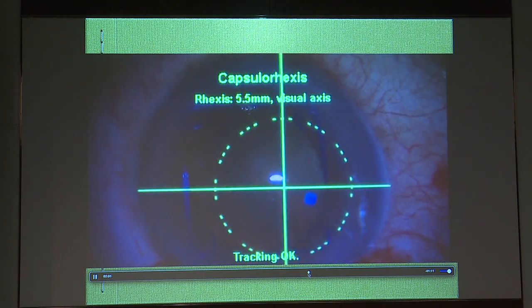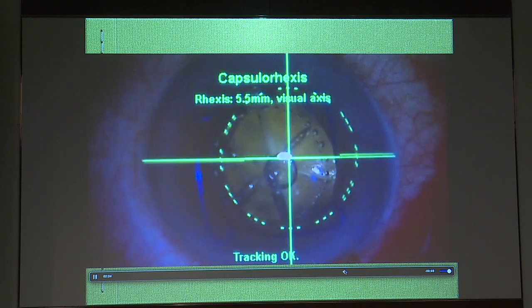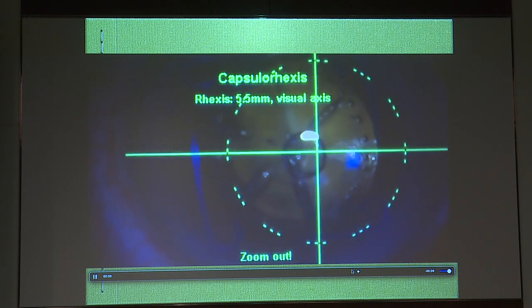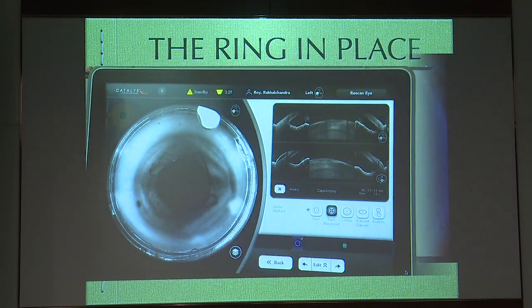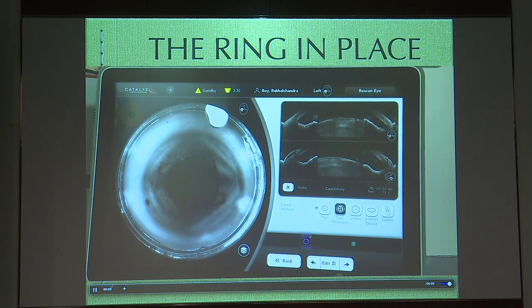And as I mentioned, a little bit of Elon-GV along the inner lip of the incision, because this incision is 2.2. And then as you see, I have done the femtorexis, I've also done the 4-segment or 8-segment division. Here I've also done that. You can see the 8-segment division. But I'll just tell you what happened on the femto. So you can see here, this is the femto bit of it.